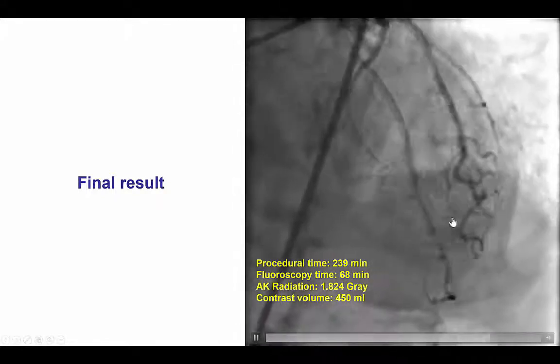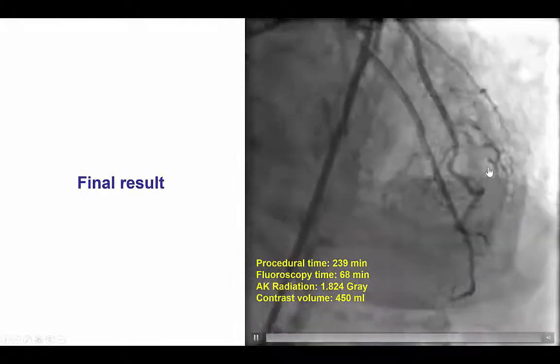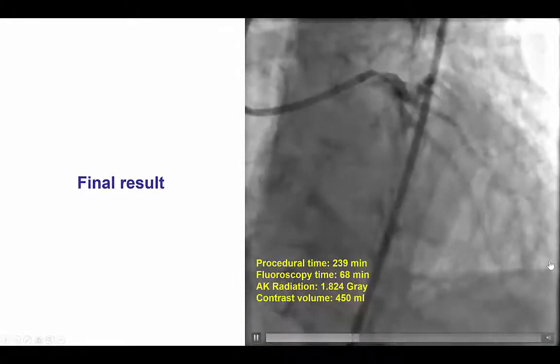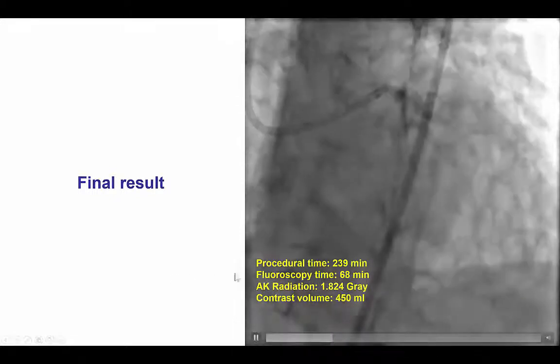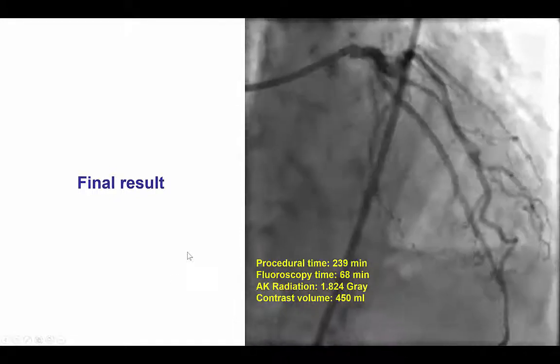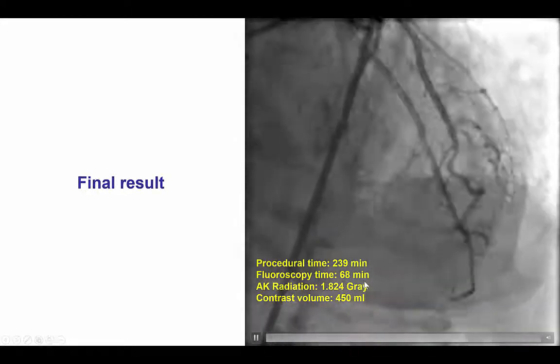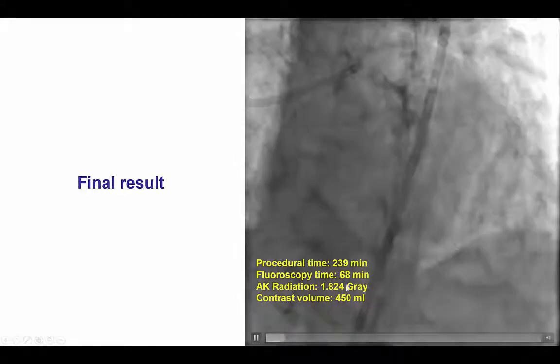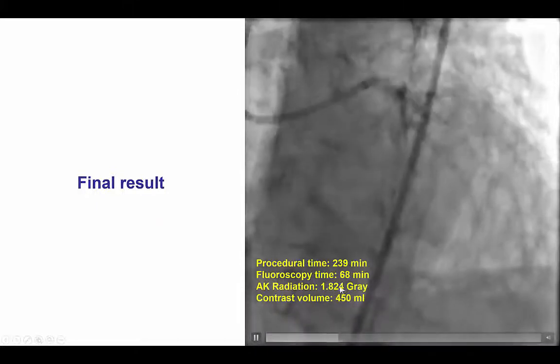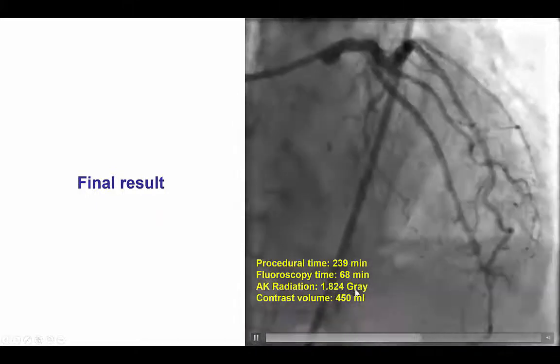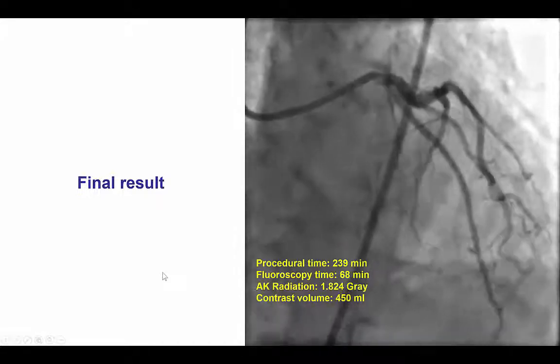We achieved TIMI 3 flow into the LAD while maintaining flow in this very large diagonal branch. It was a complex procedure requiring strategy changes from antegrade to retrograde and back to antegrade, with 68 minutes of fluoroscopy time. We used a new Siemens X-ray machine and the radiation dose was 1.8 gray. However, 450 mL of contrast were used.